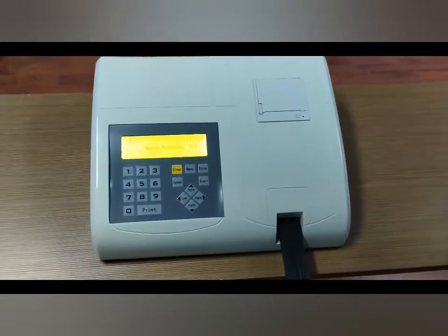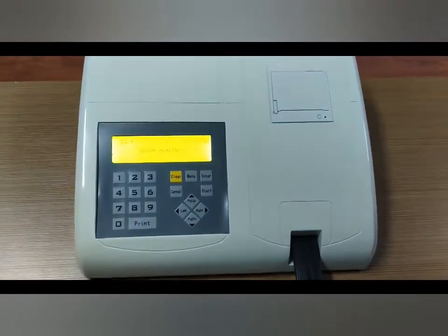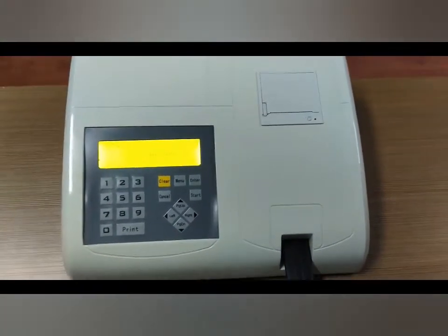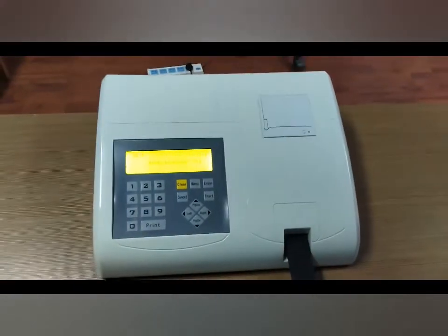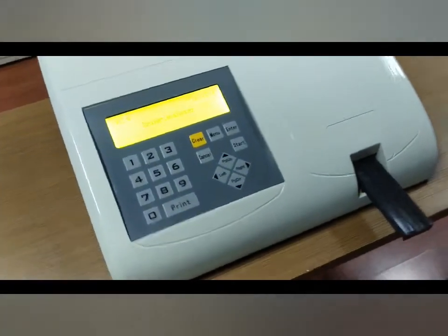The analyzer can process samples up to 120 tests per hour and can read 11 parameters. Color and turbidity values can also be imported. The original machine uses strips for best accuracy.